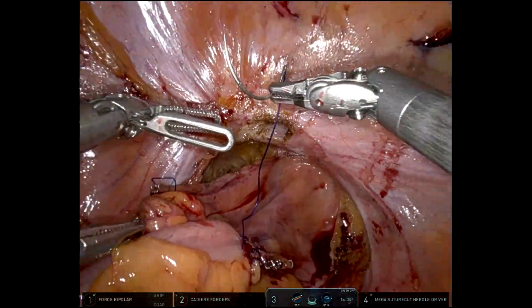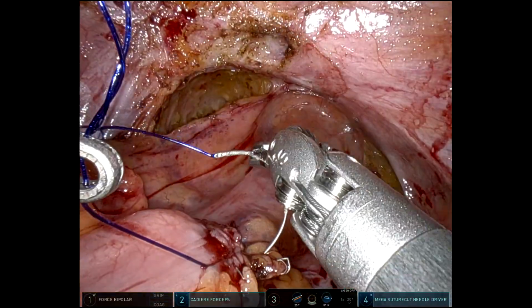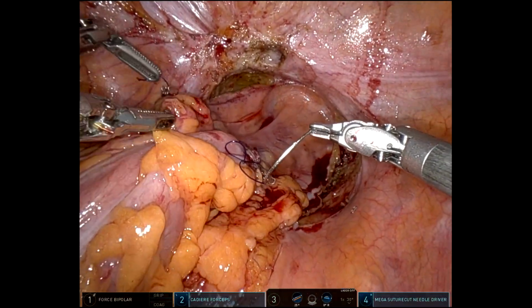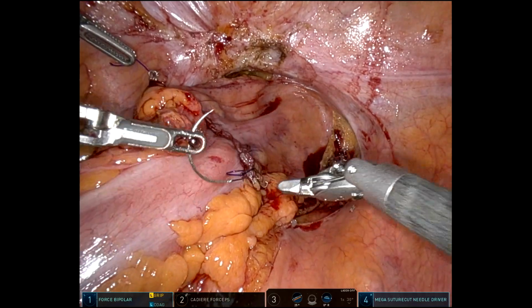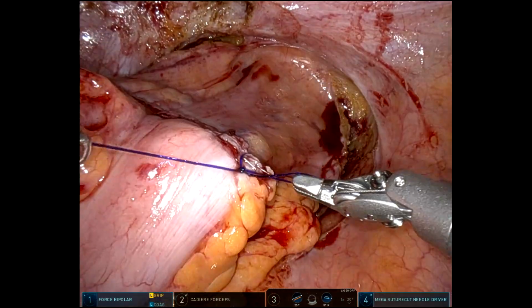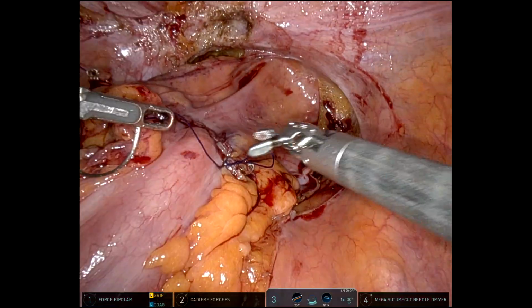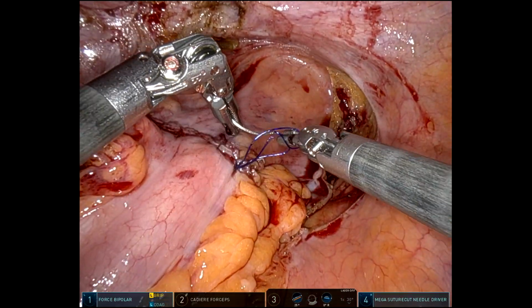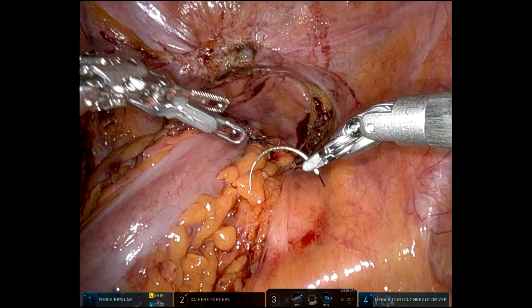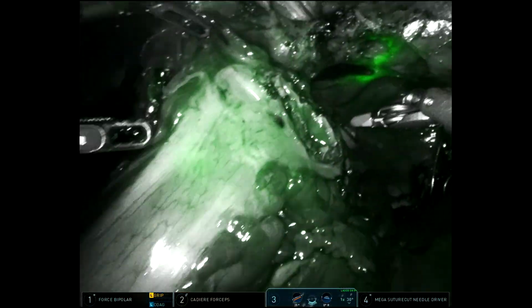You can see now how that rectum is up and above the sacral promontory, where before, after stapling, it looked like it was retracting down below the bladder. So that little mobilization maneuver there really helps out for 2, 3, 4 centimeters. And in my humble opinion, it can be easier than going up and mobilizing the flexure. I'm not trying to say that it's an alternative to, I'm just saying that it's an adjunct in mobilization.